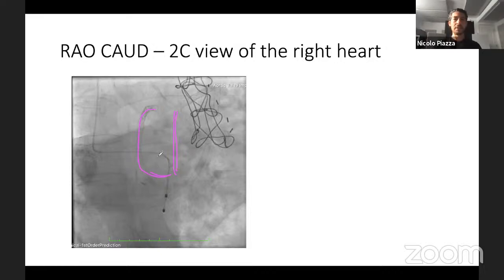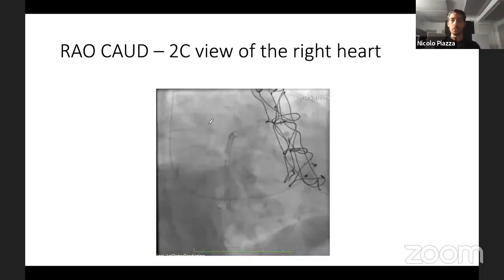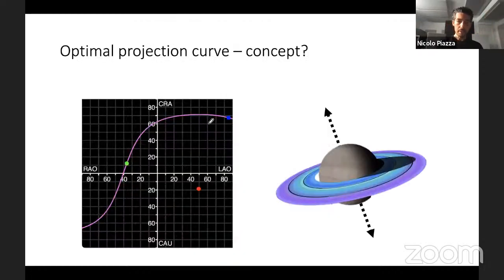Now, in order to deal with this again, you need to pull up your pacemaker and get high and ride high across the tricuspid annulus. And so when you do this properly, this is what you get instead. You can see that you've elongated the distance from your right atrium to the tip of your right ventricle. So we're not going to be talking about the right side of the heart any longer.